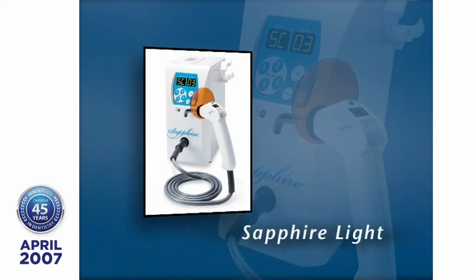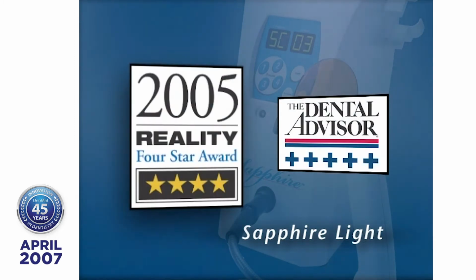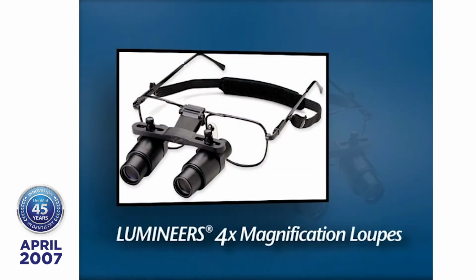Okay, we're going to use the Sapphire Light to place these in less than 1 minute. 8 porcelain veneers. Okay, then we're going to finish them, and we're going to use 4-power magnification so that when you're working without local anesthetic, you don't touch sensitive tooth structure.